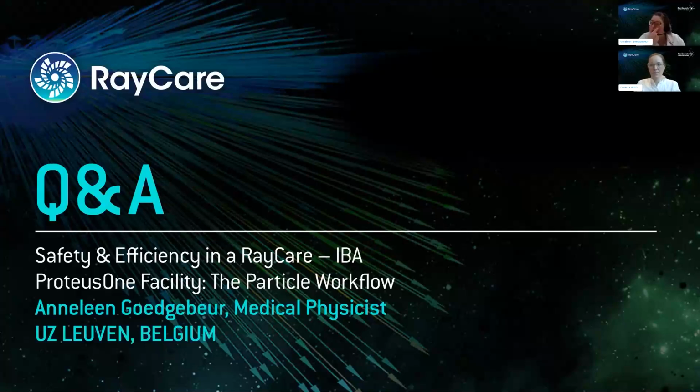So really, in order to keep your downtime down, my advice would be to include a RayCare part as part of your morning QA. Really, that's helped us a lot, especially for downtime. And apart from that, having that as part of the morning QA forces the whole team to work with RayCare on a daily basis, because you know a product better if you use it daily. So by putting that in the morning QA, we've expanded our knowledge as a team in RayCare. I don't know if that answers your question sufficiently.